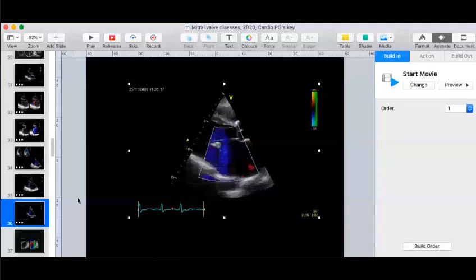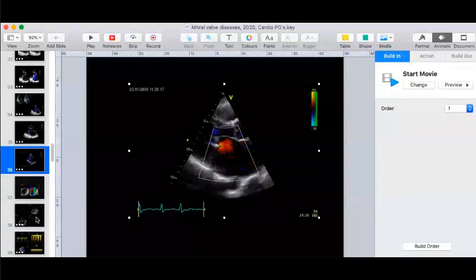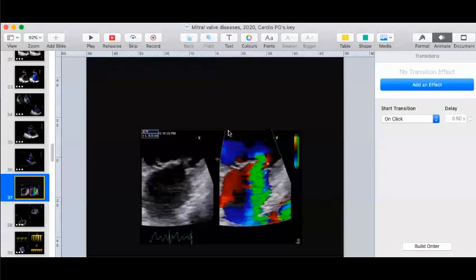So that tells you that this is a perforation. What are the common causes for perforation? Infective endocarditis. Yeah. And any transcatheter procedure like a PTMC. Okay. So now, what is being shown here? It's a zoomed view. I will give you additional information. It's an apical four-chamber view, across the mitral valve. But what is that color jet which has been frozen and shown to you? For measuring PISA. Severity, sir. It is a vena contracta.